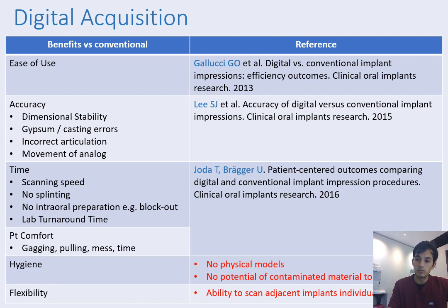In terms of patient comfort, that goes without saying. Digital is a lot more bearable for the patients to not have to contend with the pulling forces of removing a rigid impression material from the mouth. I once actually spilt a light body, bright yellow light body silicone on the patient's black sweater and had to take charge of his dry cleaning bill for that. Now, with digital, of course, that's not a factor.